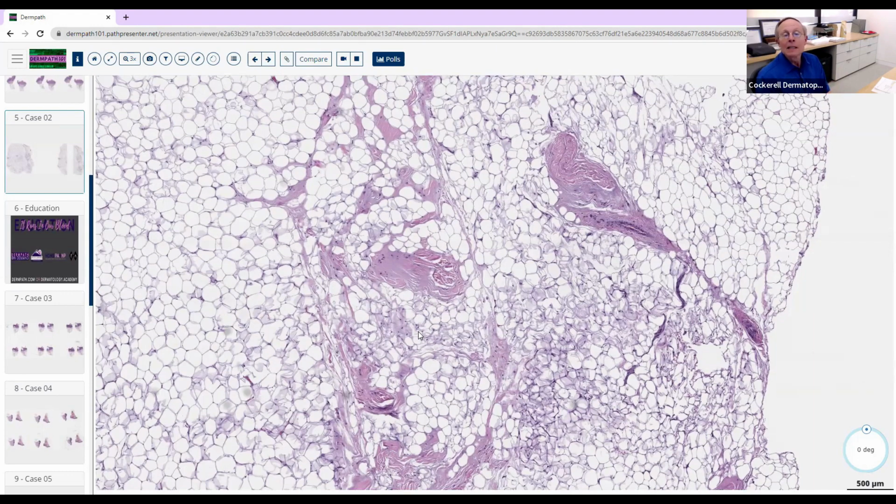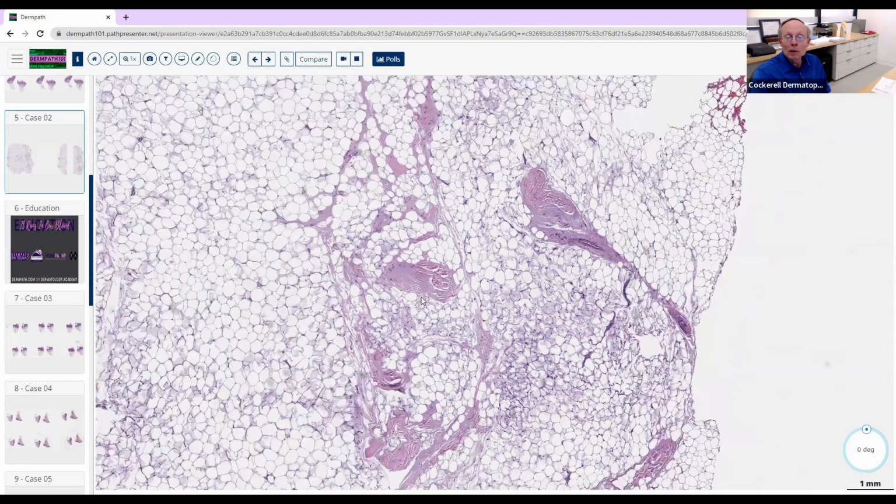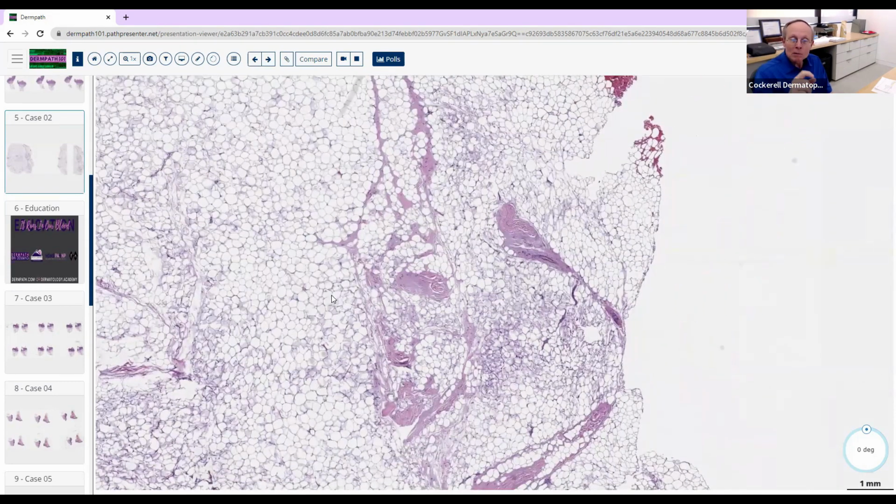So just remember that. If you see one that looks like a little marble in the skin, maybe 2 or 3 little well circumscribed lobules, think of so-called mobile encapsulated lipoma. That's yet another variant. If you see the blood vessels that you described at the periphery, that almost looks like an angioma within the lesion. It doesn't look exactly like an angioma. The blood vessels often have the erythrocytes sludged in there. They're not usually thrombosed, but you get the sludging of the erythrocytes.